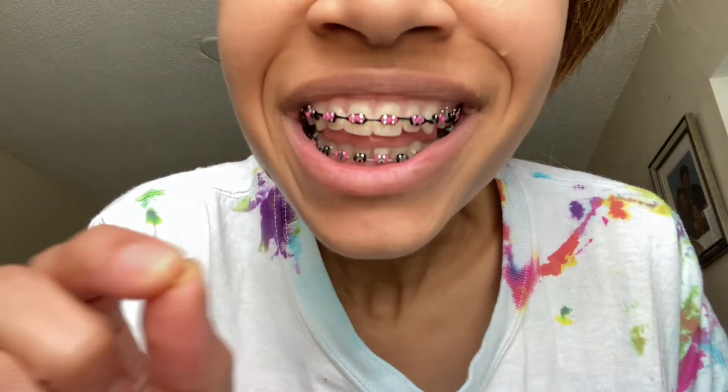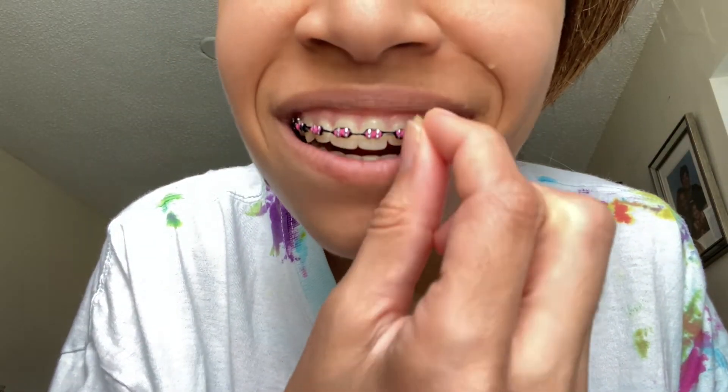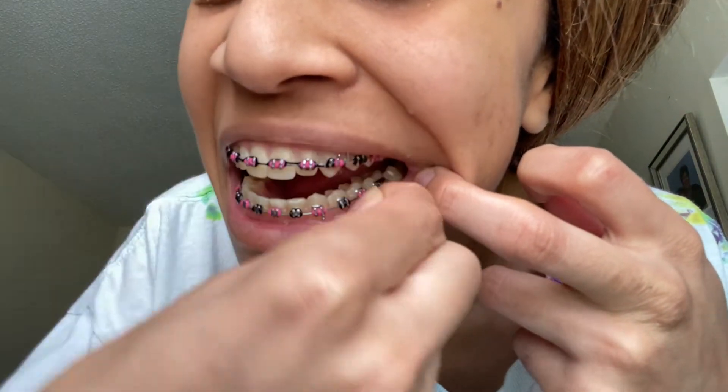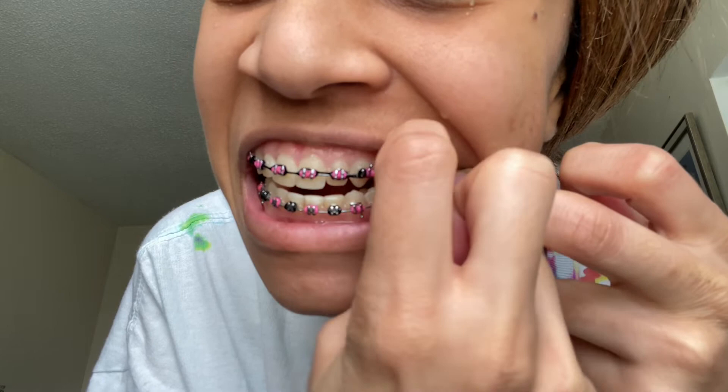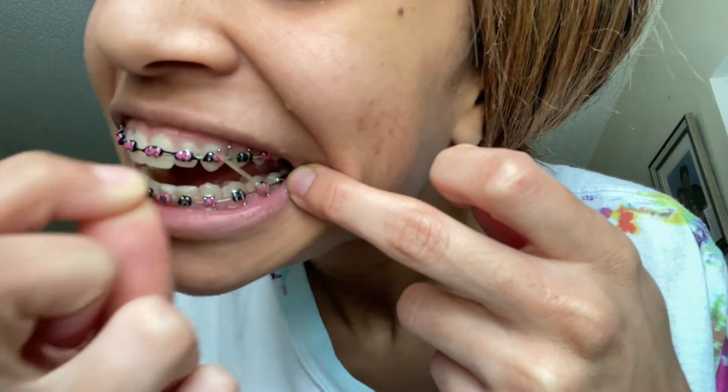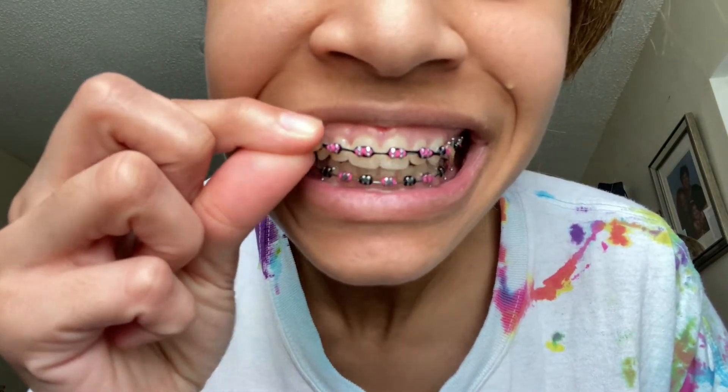Without further ado, let's get in. So the first hook — I start either from here or here. It's the last hook here, it's gonna come out to here, just like that. And it's gonna be the same on this side.